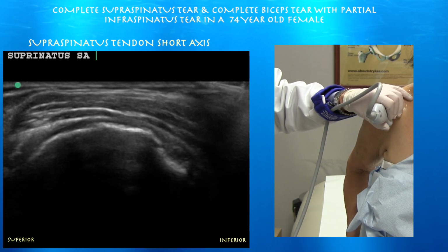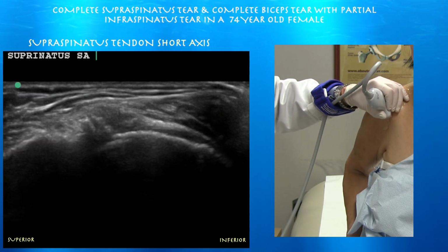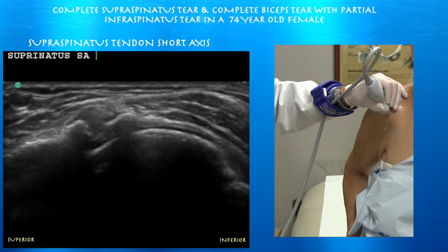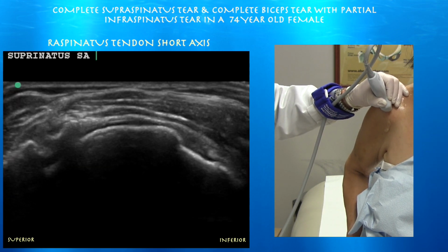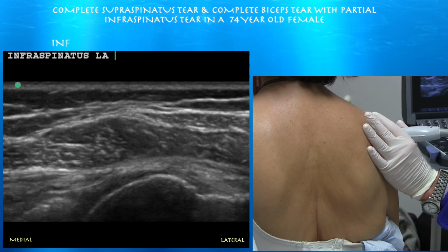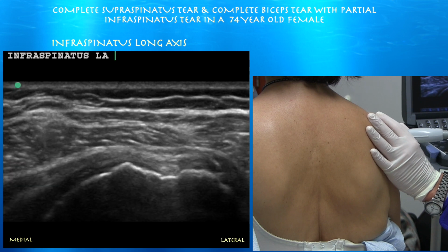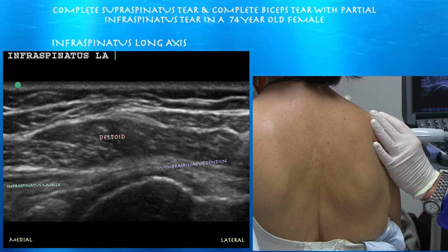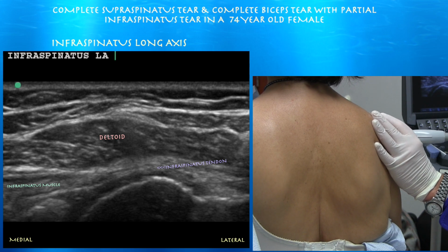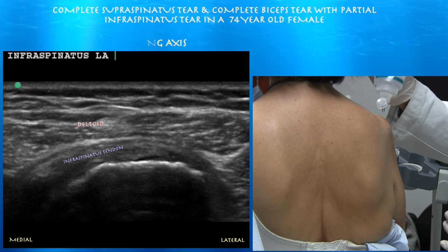And we're going down towards the bicipital groove. You don't see a biceps tendon. We're going posterior, just seeing deltoid muscle right on top of the humeral head, cartilage interface sign. Here's our infraspinatus muscle. You can see that, and then I do believe there are some fibers that are attaching onto the greater tuberosity, which I can see on the MRI as well. So I'm going to still call her infraspinatus tendon there.